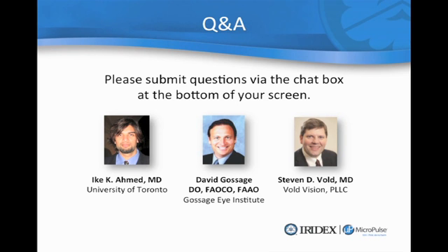What do you think, David? I agree. I mean, 1,000 milliwatts, like I said, they do feel a little bit. It seems like they feel it more in the horizontal meridian around 3 and 9 o'clock. But I'd like to see really an EM microscope of the trabecular meshwork with a little bit higher setting just to see what type of thermal uptake you get.